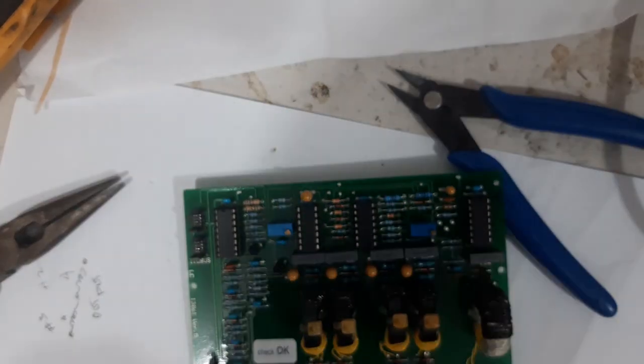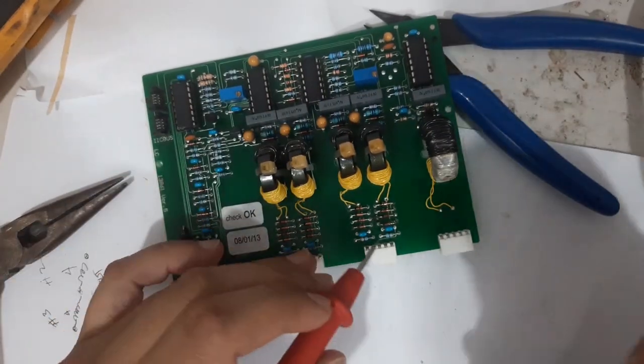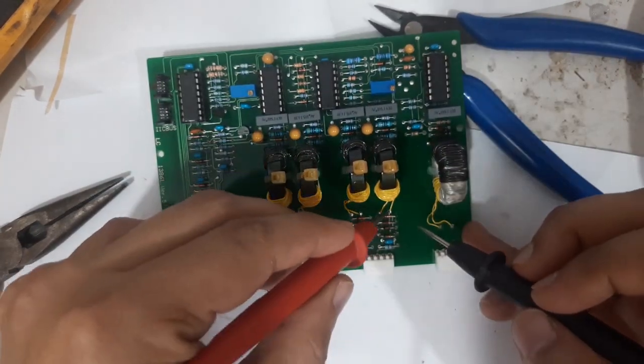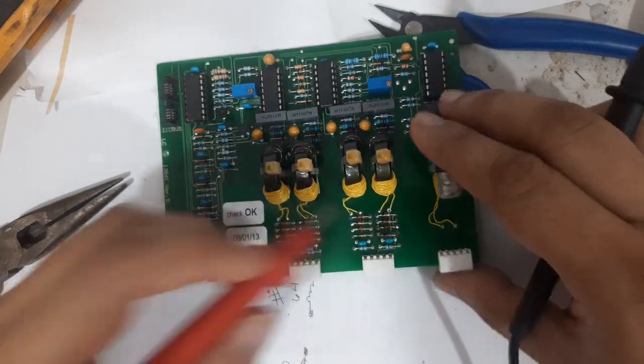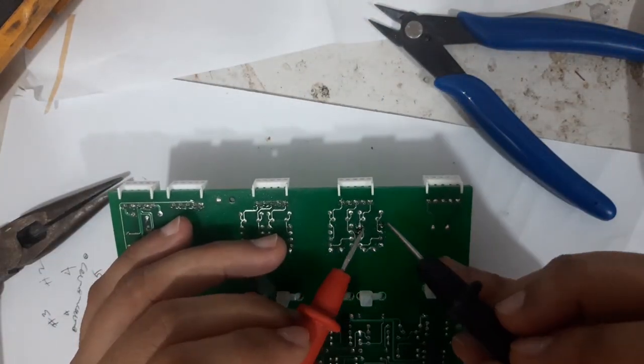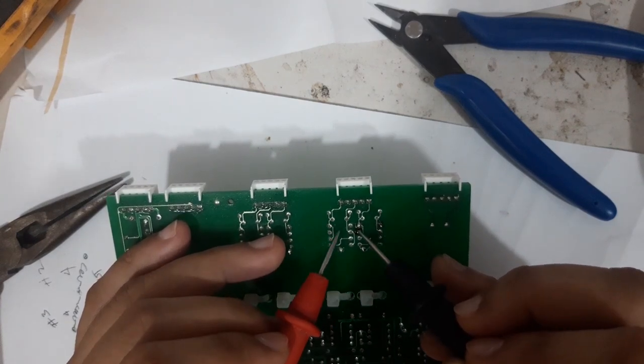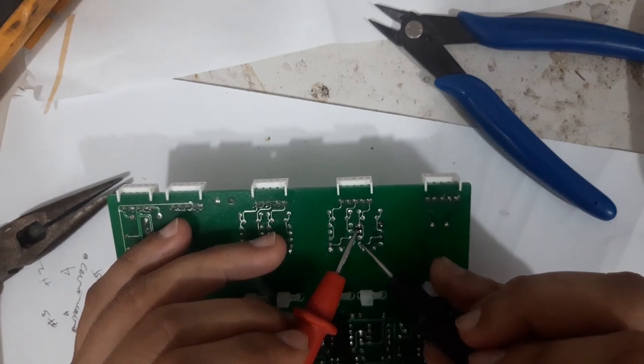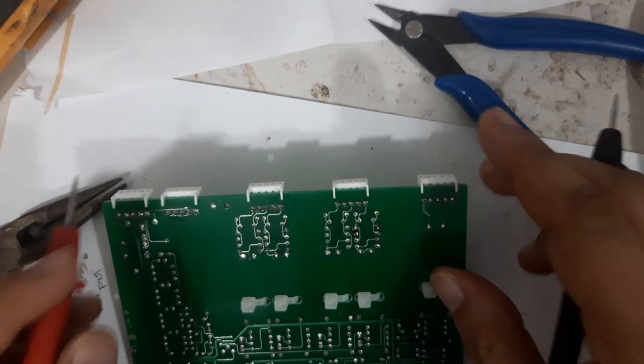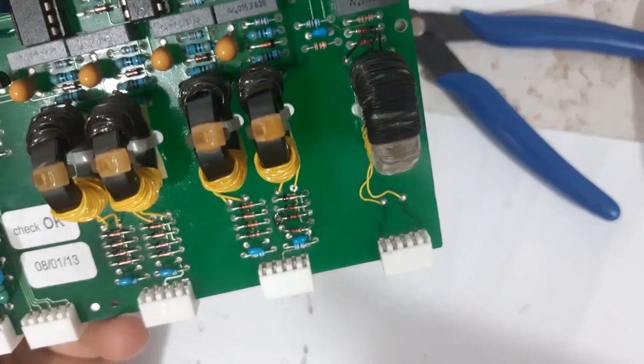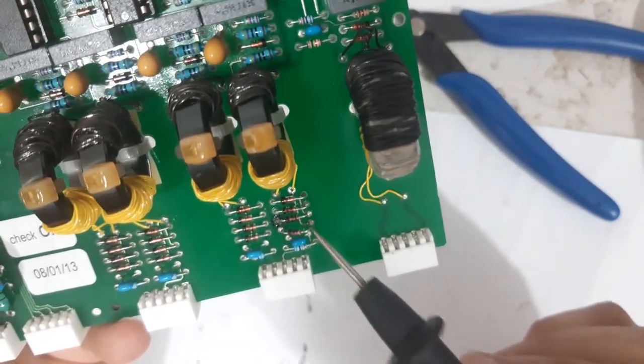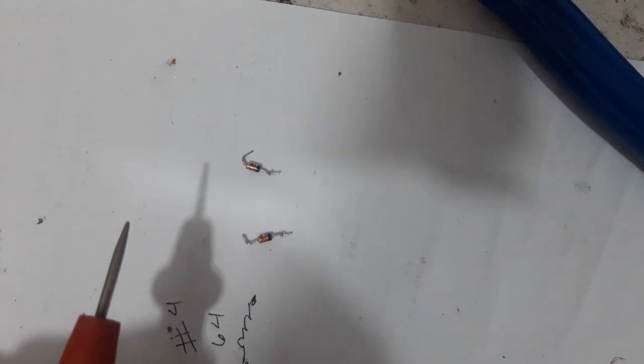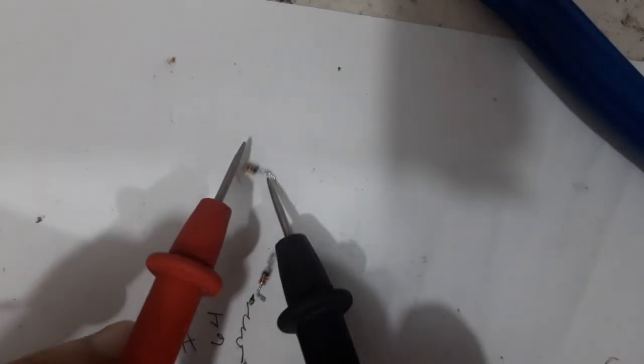Again we will check the continuity. So this is okay, and from here, this one, okay. So this one now, these are the two zener diodes that we replaced, and this is the old one that we removed, these two. See the short.